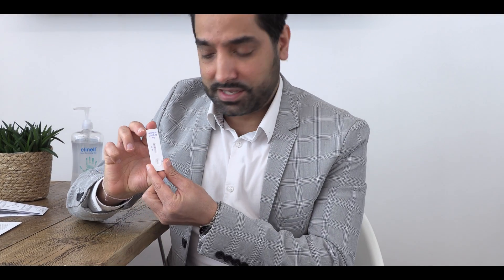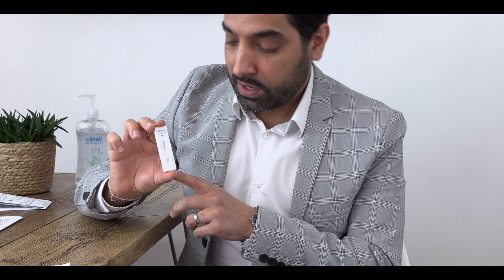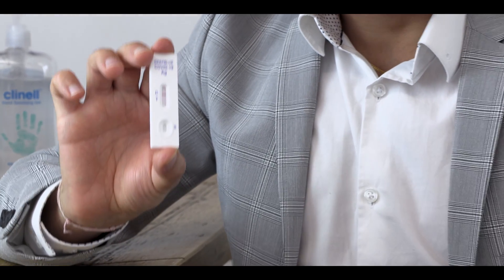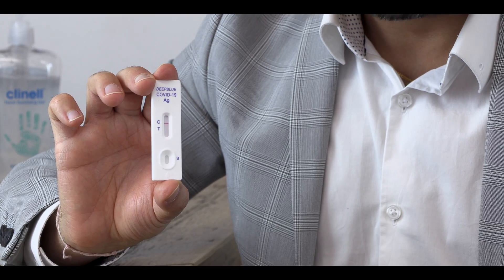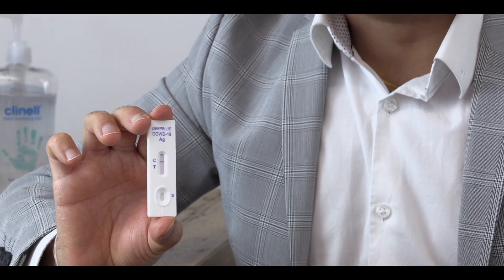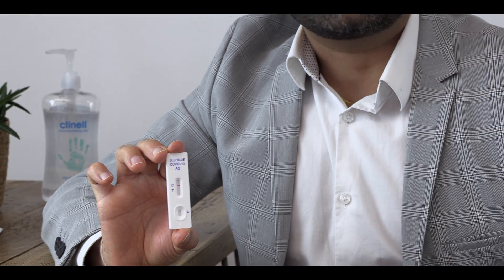Once the 20 minutes are up, we can start to interpret the results. Look at your testing cassette on the results section — you'll see there's a C and a T. If you've got a line next to the C, that means the test is valid and has worked. If there is no line at the C, the test is invalid and you may need to repeat the test. If you've got a line next to both the C and the T, that means you have tested positive, and at this point you should start to self-isolate and organise a PCR swab test to confirm the result.